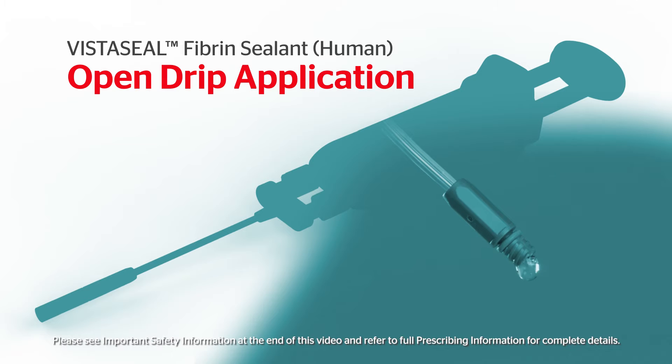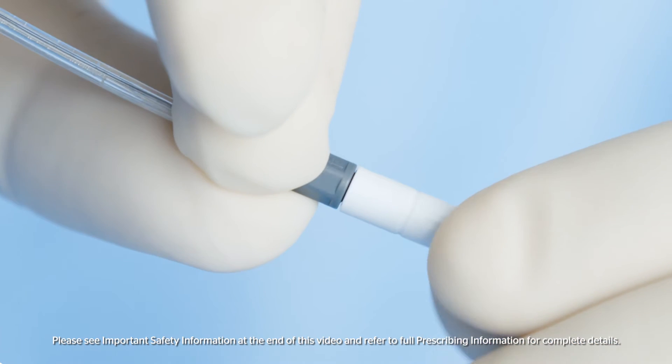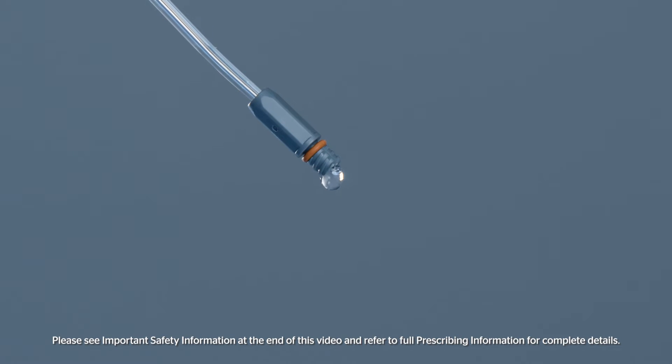VistaSeal can be applied using a drip method. Remove the airless spray tip by unscrewing it from the tip connector and keep the tip as close as possible to the tissue surface without touching it. Apply individual drops to the surface area to be treated. To prevent uncontrolled clotting, allow the drops to separate from each other and from the end of the tip.